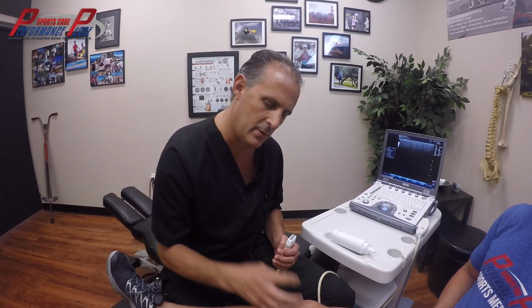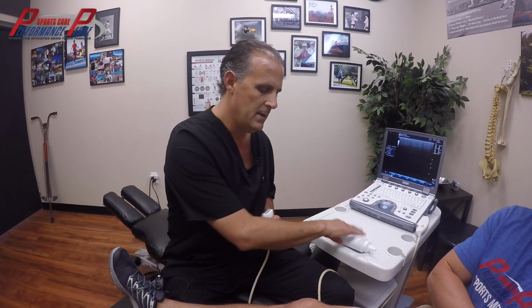Welcome everybody today to musculoskeletal ultrasound of the knee. This is the same ultrasound that everyone's familiar with looking at babies, looking at the heart, blood vessels, same exact technology. Only today we're going to be focusing in particular on the knee. And one of the greatest advantages of ultrasound is the actual point of care, being side by side with the patient and being able to look right in, following symptoms and taking it from there.